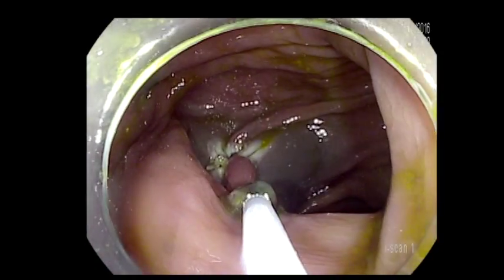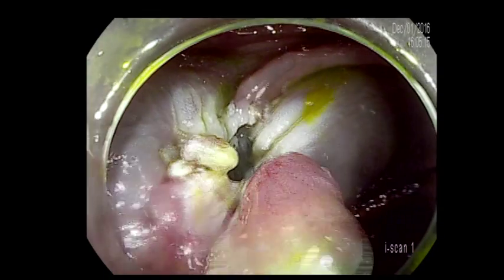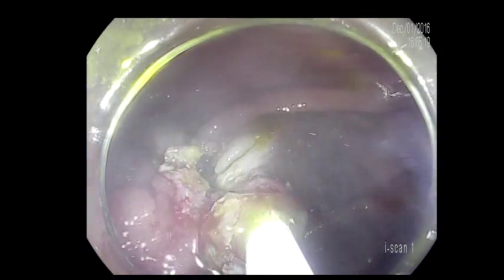I'm going to advance the scope closer to the polyp. Certainly, you do not want to cut when you're that far away — you have to be a little bit closer and see what you're doing when you are doing polypectomy and applying current. After removing the second piece, we'll inspect the base of the EMR again, and it looks like we still have a large part of the lesion there.